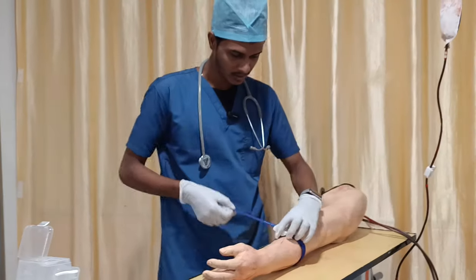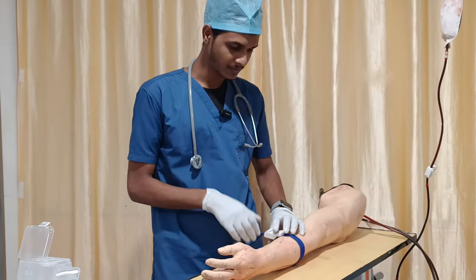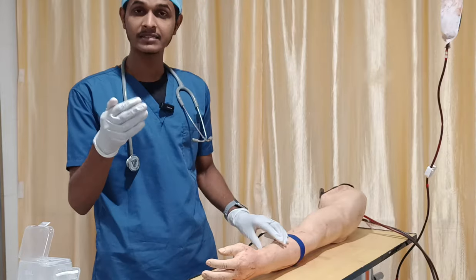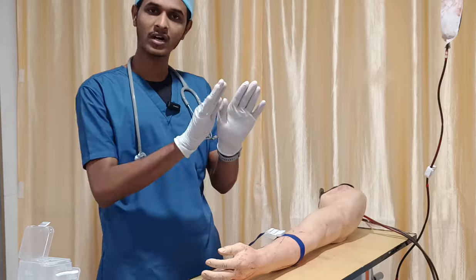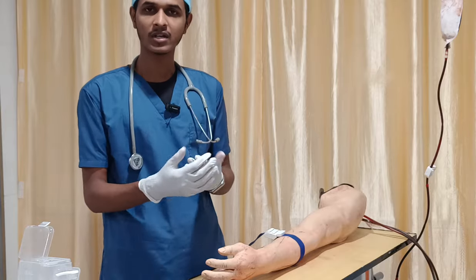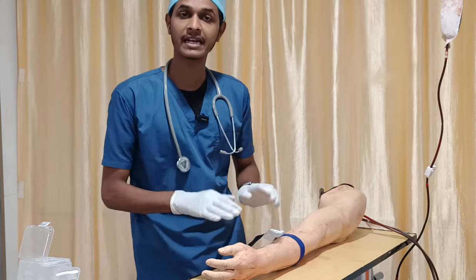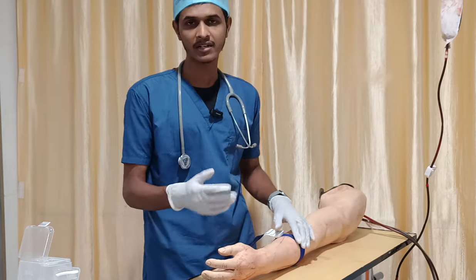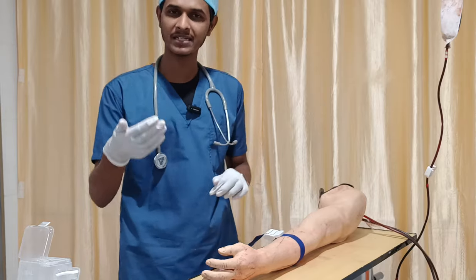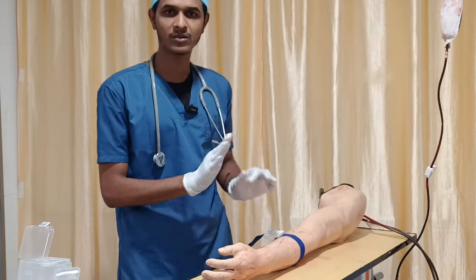Okay, so I am going to apply the tourniquet. You have to give a moderate pressure. That pressure will only occlude your venous supply. So that is enough to occlude the venous supply. You should not give more pressure, as it might occlude the artery also. So I applied minimal pressure, and then you have to wait for the engorging of the vein. Venous circulation is a passive one, so it will take around 30 seconds to 1 minute. Until then you have to wait.